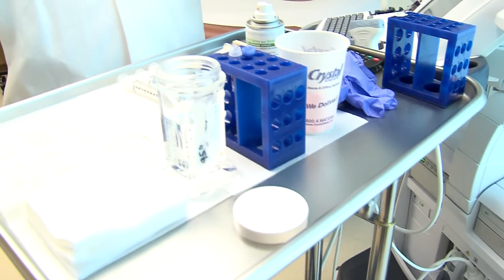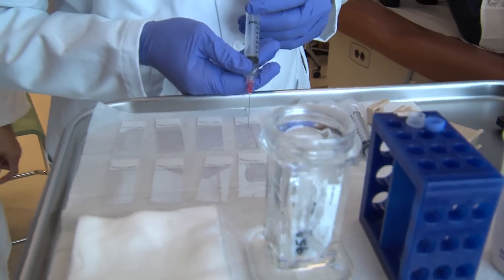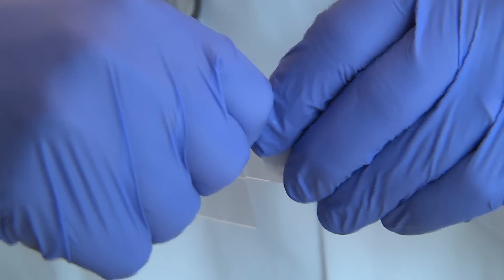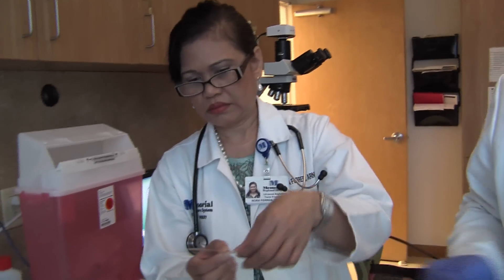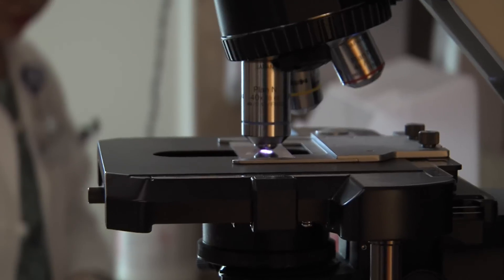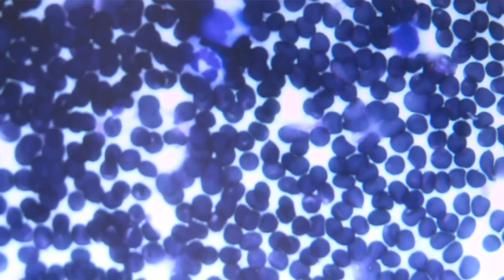We're set up to do four biopsies here. After I remove the needle from her neck, I'll come over and put the contents of the needle onto one or two slides, and quickly make a teardrop smear on each of those slides — putting one into alcohol and taking the other one over here to do a staining procedure on it with DIFQUIK. We'll then look at it with our high-resolution Olympus microscope. We do that to make sure we get plenty of specimen for the cytopathologist, so we're not calling the patient back a week later telling them there were not enough cells on the slide for interpretation.